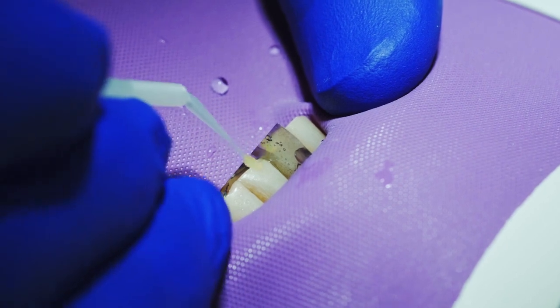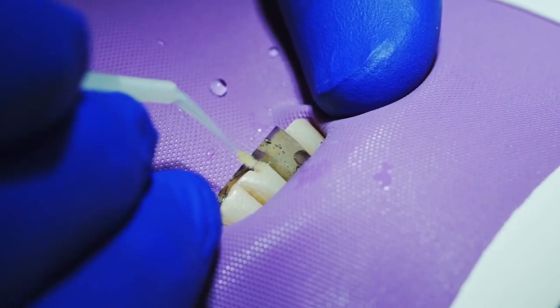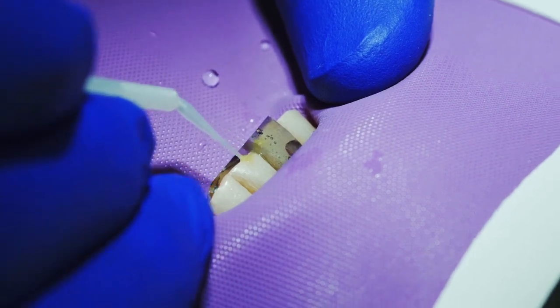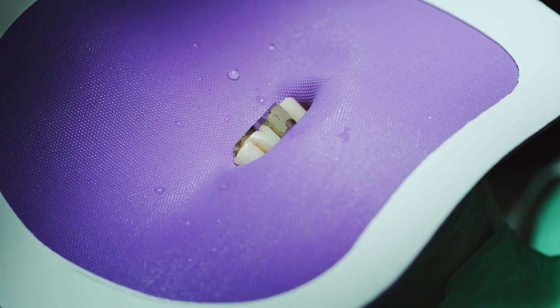This young lady's tooth has been broken multiple times and repair attempts have been made multiple times. This is a hard place to keep a filling. We air dry it.